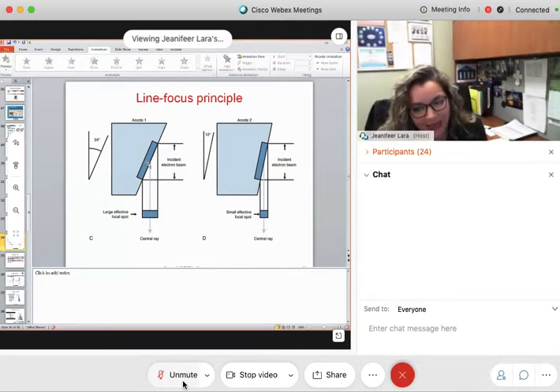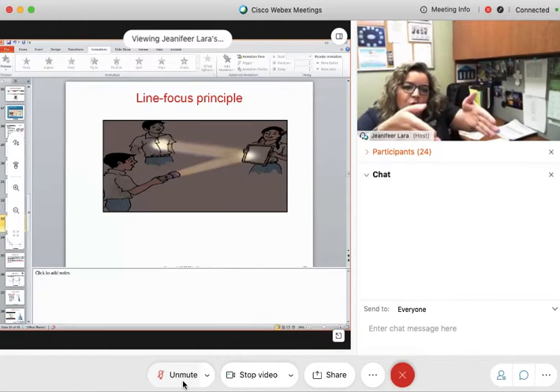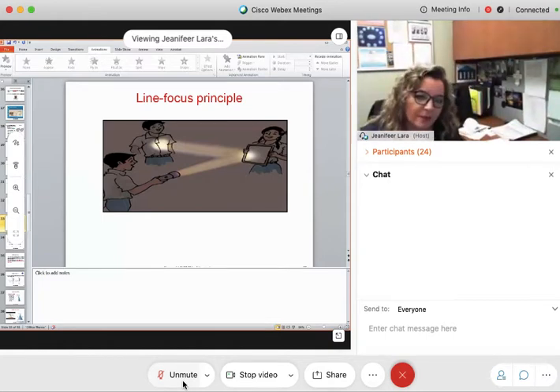So, as the electrons hit the target, we have two types of conversions. That interaction is going to convert to heat, which is going to be dissipated. How? But you know what? Let me get to that second. The X-rays are going to be guided away from the target and funneled, almost like a funneling. We are redirecting where we want that X-ray beam to go.